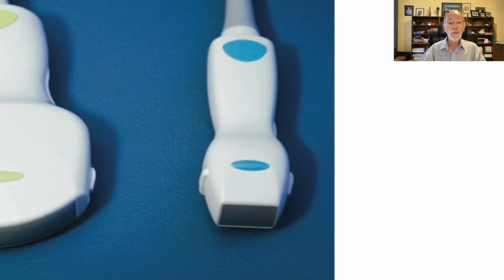On the right, we have a far more compact probe, which is a phased array probe, quite often called a sector probe. These are used almost exclusively in echocardiography. The reason is that they are so compact. So this probe uses a very small window to get the ultrasound into the tissues. And this, of course, is perfect when, for example, you're scanning the heart through the ribs or various other windows.